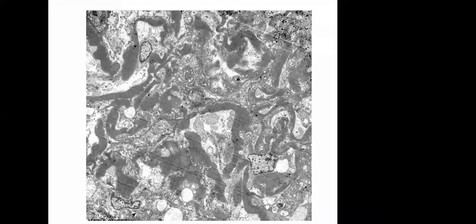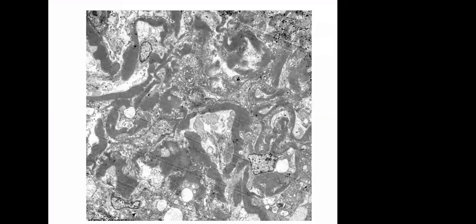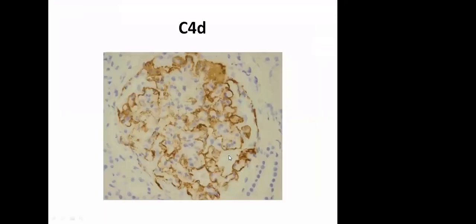So IgG, IgA, and C3 were negative. Or C3 was very minimal. So it was confusing because all the immunoglobulins are negative, the complement is negative, and morphology is showing those kind of massive deposits. Even on Masson's trichrome, you can find those deposits. When we did electron microscopy, it showed dense osmiophilic deposits along the glomerular basement membrane.